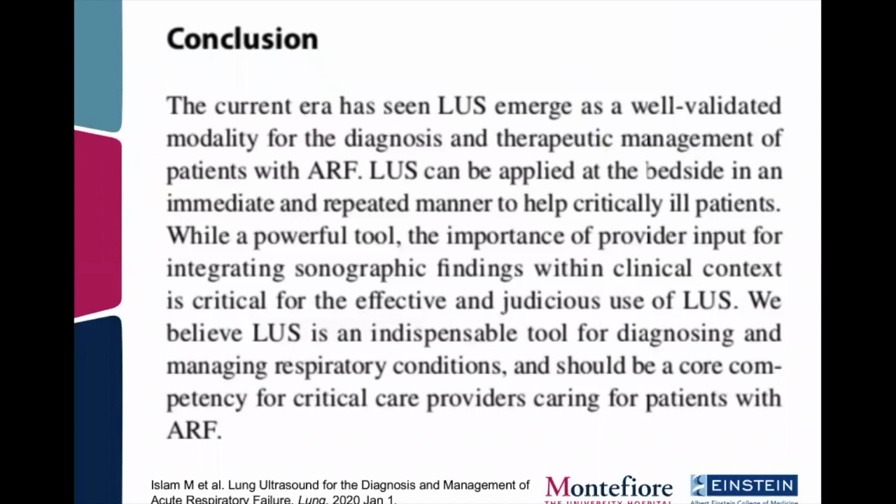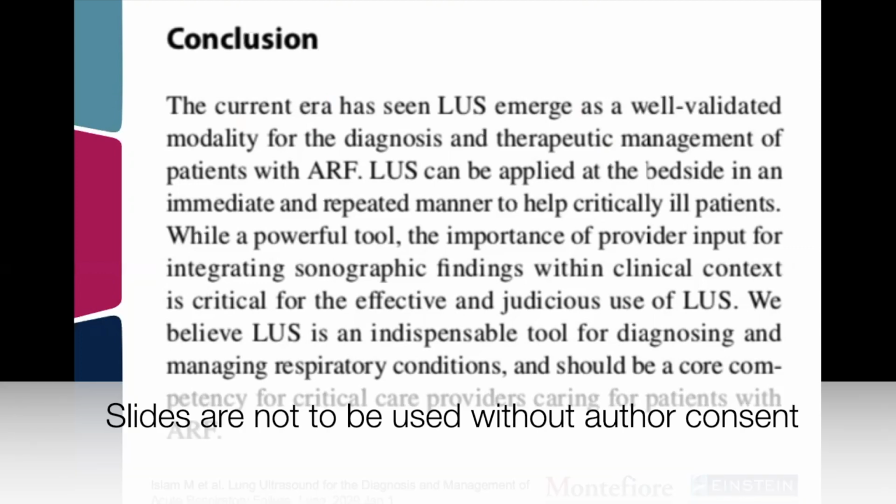So to conclude now, I'll just read the conclusion that we wrote in our paper. The current era has seen lung ultrasound emerge as a well-validated modality for the diagnosis and therapeutic management of patients with acute respiratory failure. Lung ultrasound can be applied at the bedside in an immediate and repeated manner to help critically ill patients. While a powerful tool, the importance of provider input for integrating sonographic findings within clinical context is critical for the effective and judicious use of lung ultrasound. We believe that lung ultrasound is an indispensable tool for diagnosing and managing respiratory conditions and should be a core competency for critical care providers caring for patients with acute respiratory failure.